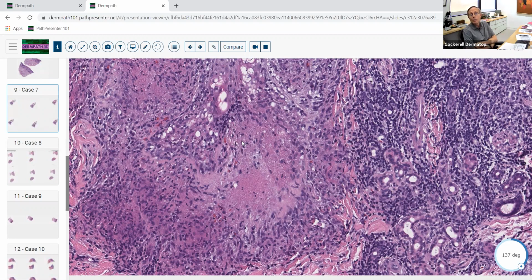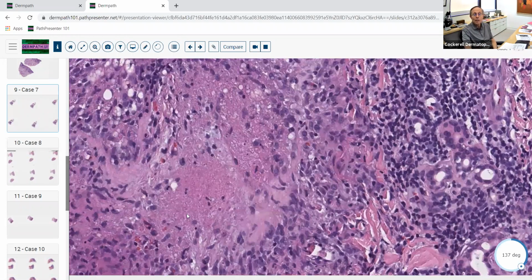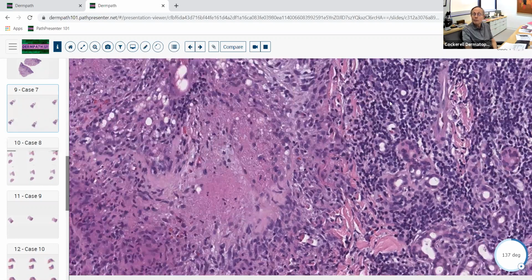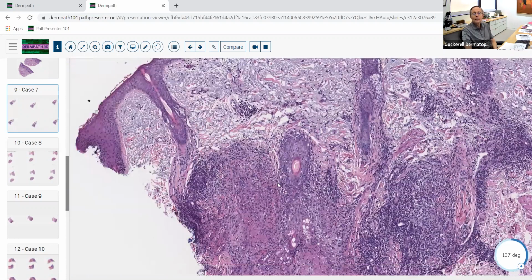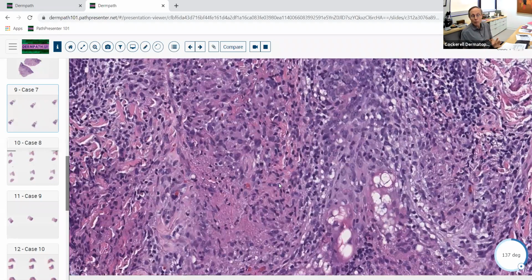It can be seen in other infections too, but probably the most common setting where we see it today is in Granulomatous Rosacea. And that's exactly what this biopsy is of. It shows the tuberculoid pattern of inflammation that we see with Granulomatous Rosacea with a lymphocytic infiltrate around it. Very common pattern that we see with rosacea. And this is not suppurative granulomatous, at least in this field.